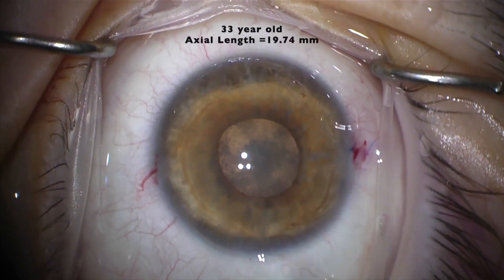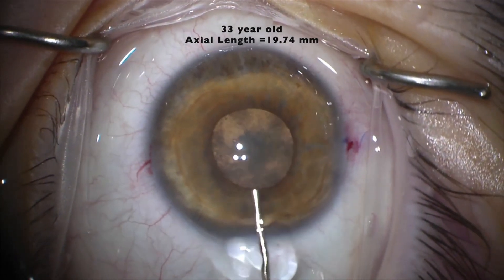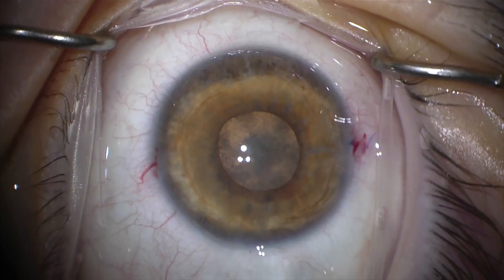This is a young patient with a cataract and a short axial length of 19.74 mm. The anterior chamber is very shallow. We attempted to deepen the chamber with cohesive viscoelastic, but this was unsuccessful.